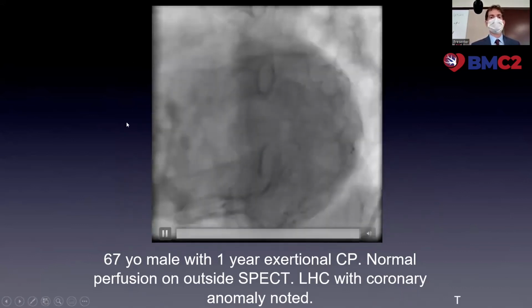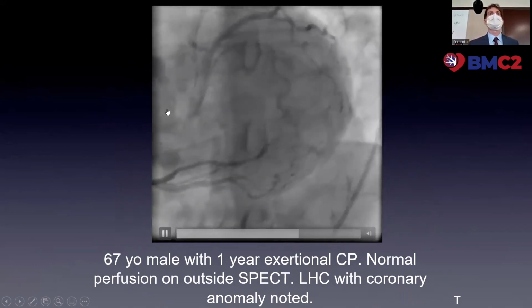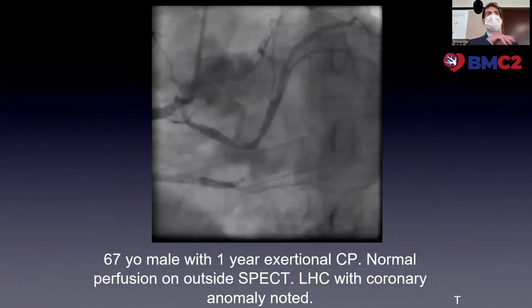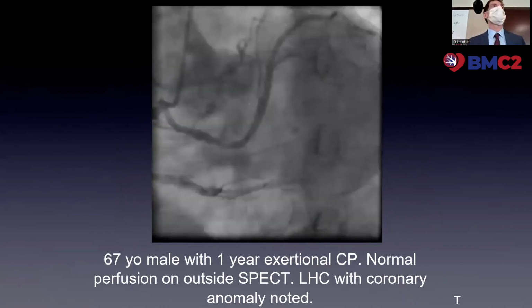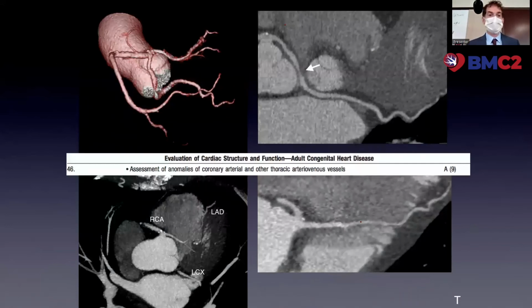This patient has essentially a single, all the arteries come off one left main from the heart. So normally there's a left main that gives off two main arteries, and then there's a right coronary artery that gives off another artery. So this patient was just born with arteries that are connected in a different way. And sometimes these can cause problems.